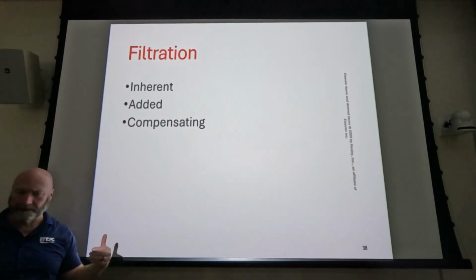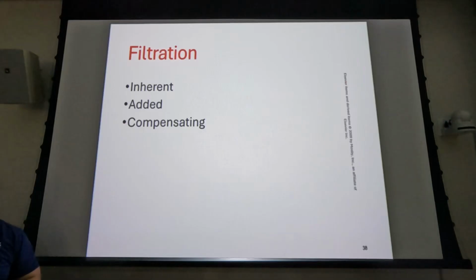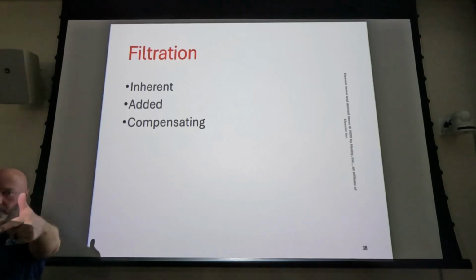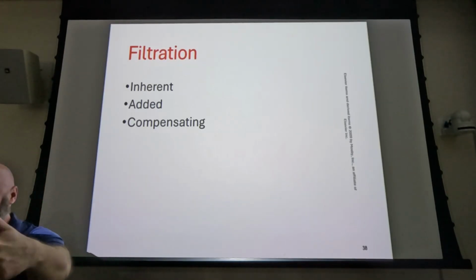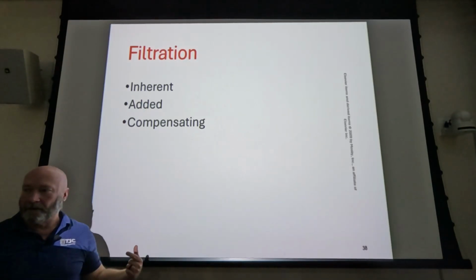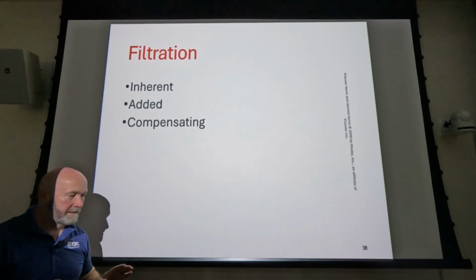And what we'll do in scoliosis series, I know we talked about this at the end of last semester, but we'll do a number of things. Because our demographic for scoliosis series is generally young women with developing breasts, we want to minimize the dose to those breasts. So we'll put these trough filters on, which are basically double wedges, and they go on the x-ray tube, or at least between the x-ray tube and the patient, right? And the purpose for those is to limit the beam.